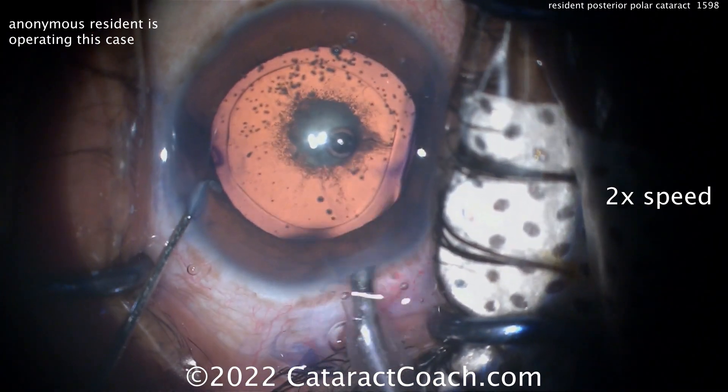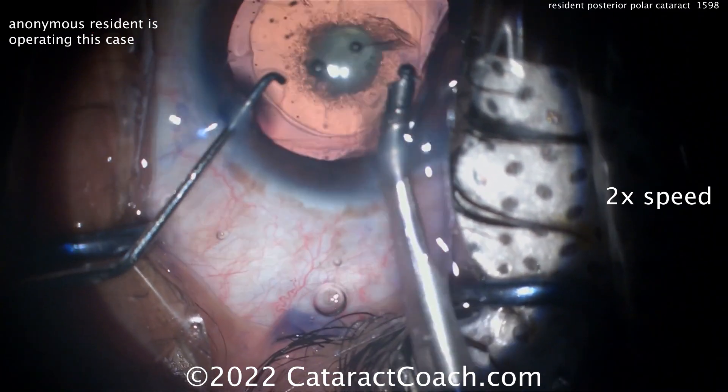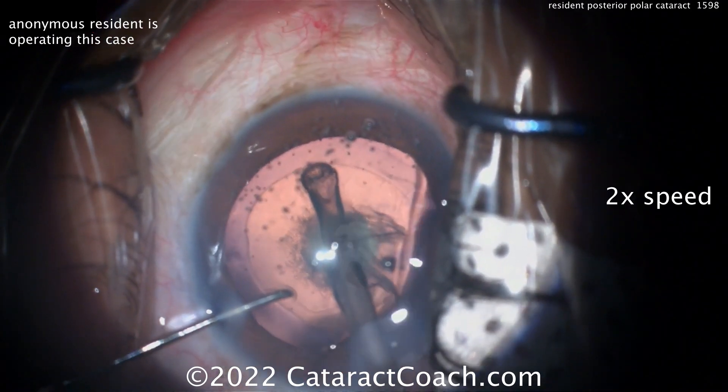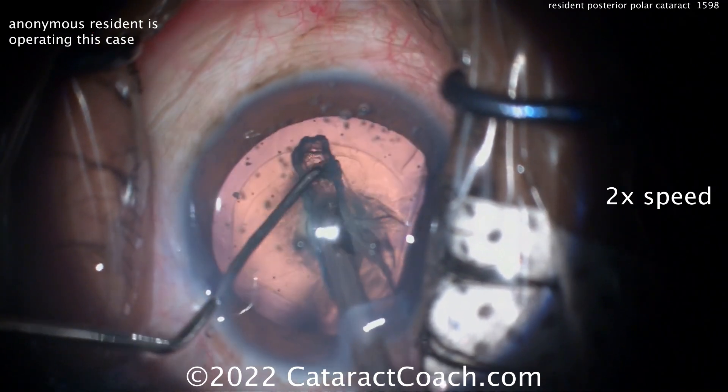In this younger patient, that trypan blue dye does help to stiffen up the lens capsule. It's a great red reflex, so you don't really need the trypan for that reason, but it does stiffen the lens capsule. Judging by that nuclear density, maybe the patient is in their late 40s or early 50s.